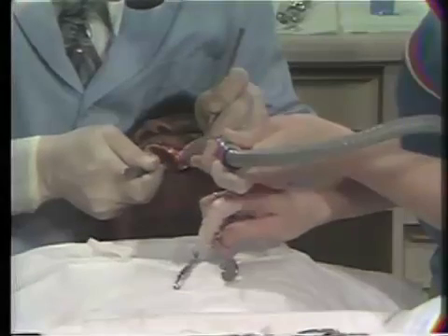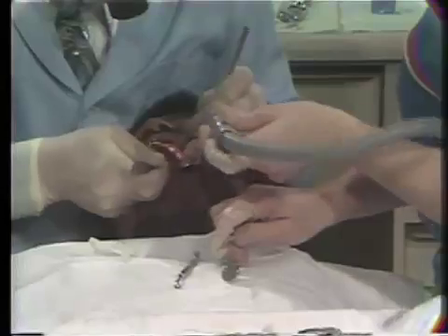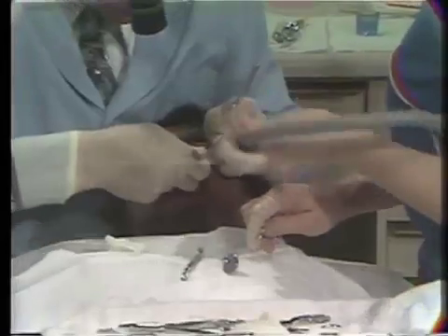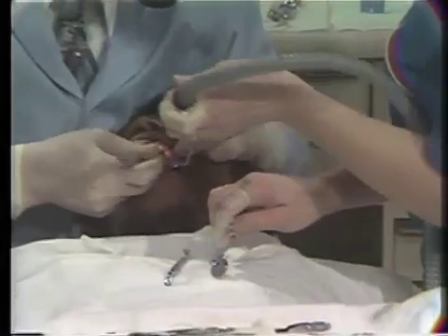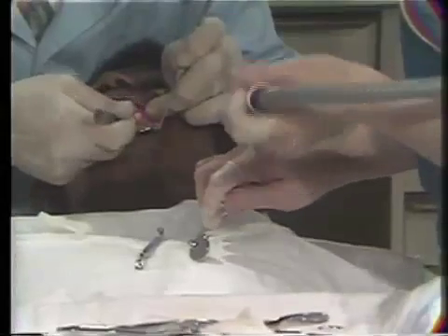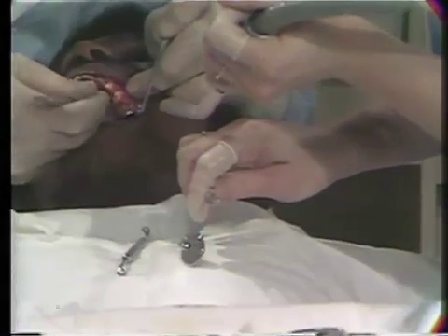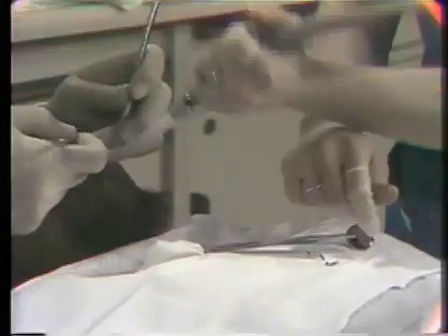If you notice, she has a sponge right underneath your right hand that has been moistened. And that sponge, if you'll notice, on occasion will be used to wipe off the mirrors. And then she'll put it in the alcohol torch on top of the dental unit to warm it prior to handing it to me.